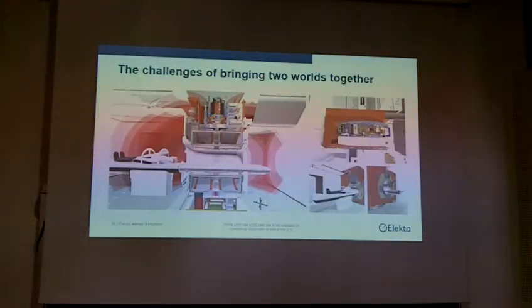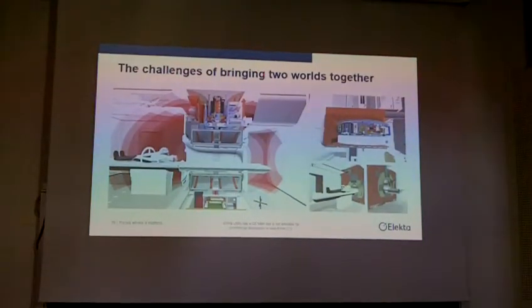Also, for the isolation of the MRI from the linac, the beam is going through the MRI. The magnet coils are specifically designed such that the active shielding protects the linac, and also such that the radiation beam can pass, as I said, through the MRI.